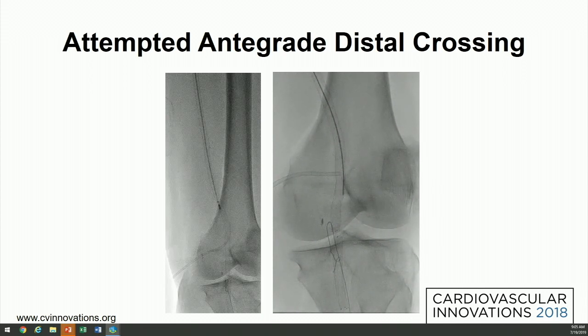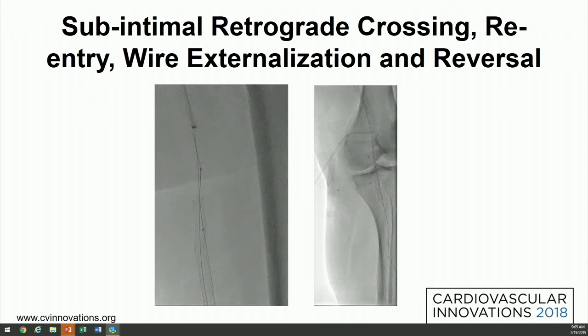However, despite several attempts to wire into that distal popliteal stent, due to the non-overlap area here, we were not able to get the wire to go through all the stented segment down to below the knee. And so here we rallied our surgeons and we discussed our options. The patient had previously refused a surgical approach multiple times, and he had a suboptimal target, being very low below the knee.